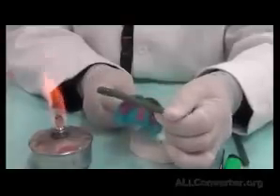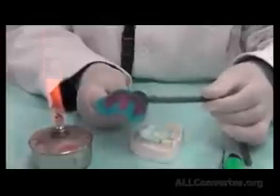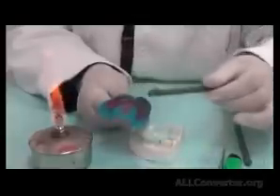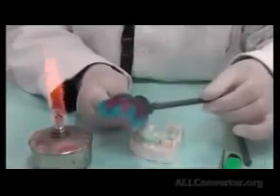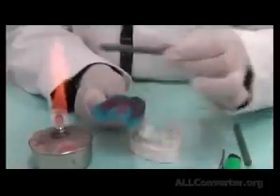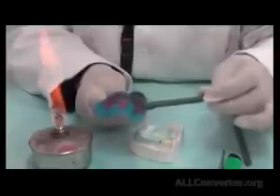And this flow comes once the heat reaches the core of the material. And I begin adding. If it doesn't stick instantly, I take it out and heat it. I want it to stick on its own. If it stops sticking, I heat it once more. Okay, it's sticking and it's flowing. And I stop here.